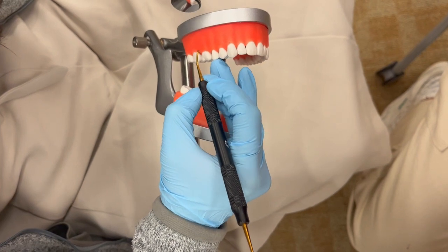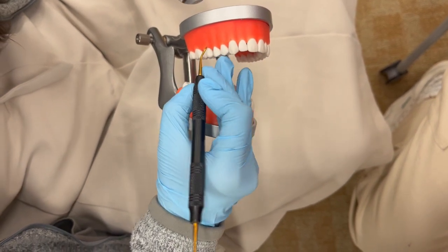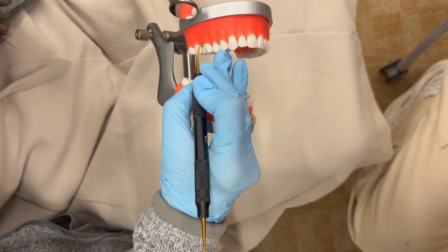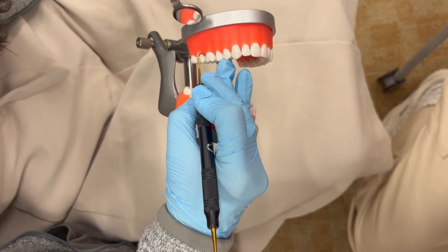Right now I'm demonstrating the Blackjack, and it's a posterior sickle. So for method 1, you want to use the lower shank as a visual cue. First, you want to establish a finger rest. Next, you want to place the working end in the get ready zone of the distal surface. Then you want to use the lower shank as a visual cue.